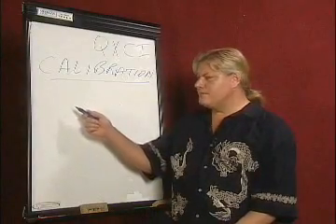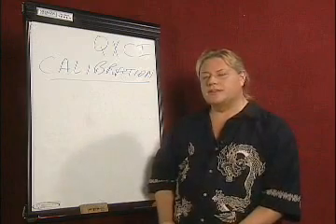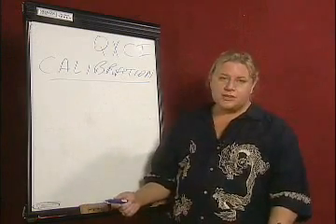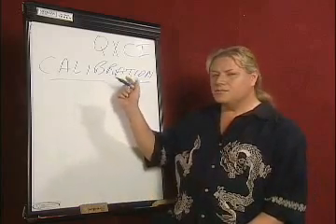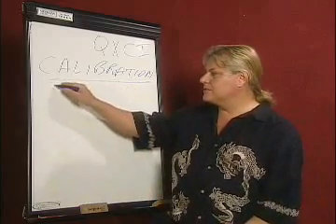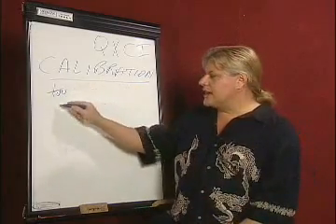Calibration. If we're going to be measuring the reactivity of a patient, we have to be able to calibrate to that reactivity. And the reactivity of this patient is in the 100th of a second range. So for us to be able to calibrate, we're going to have a system that's going to be able to measure in that 100th of a second. How does the QXCI do that?